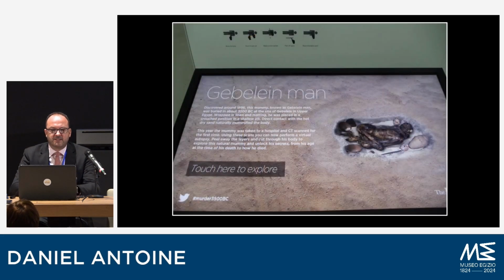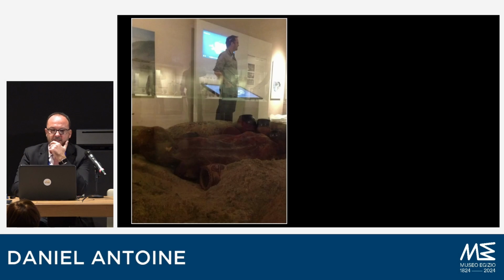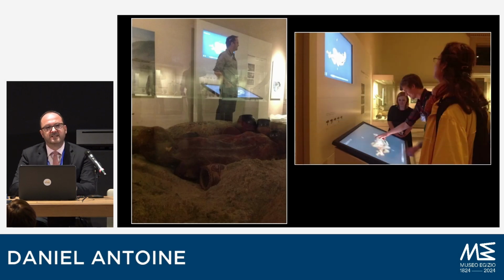And then all this really started when I started at the British Museum in 2009, and I realized that we had a pre-dynastic mummy, so a mummy that was naturally preserved from the pre-dynastic period, before Egypt was unified by the first pharaoh, that was on display, and there was very little information about Gebelein man. So we CT scanned him in 2012, and we had a 6 months display.